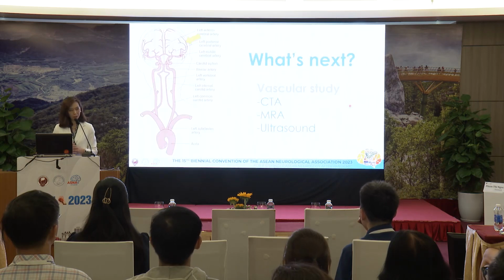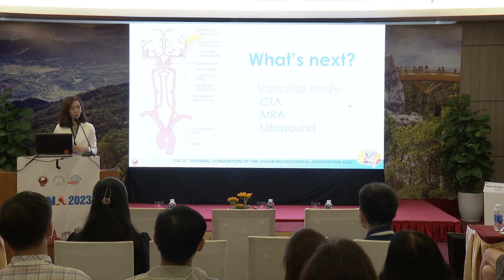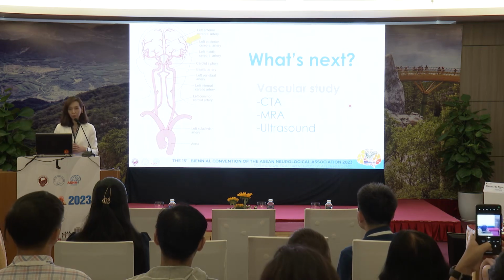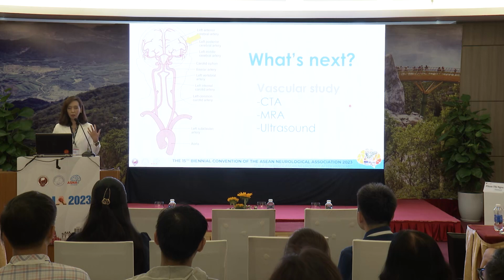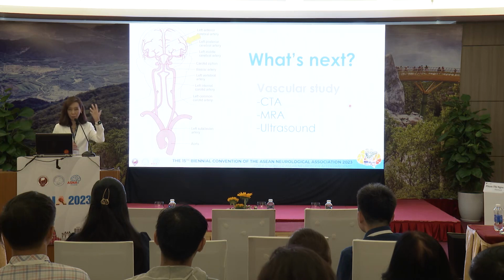So the next thing we should consider is to look at the blood vessels that supply the brain on that side. It's likely to be in the territory of the middle cerebral artery because she's having weakness in the arm. Sometimes she had aphasia, meaning there is cortical involvement. So it's likely to be the MCA territory. When you want to look at the blood vessels that supply the MCA, you look at the carotid on that side, and also the MCA on that side.